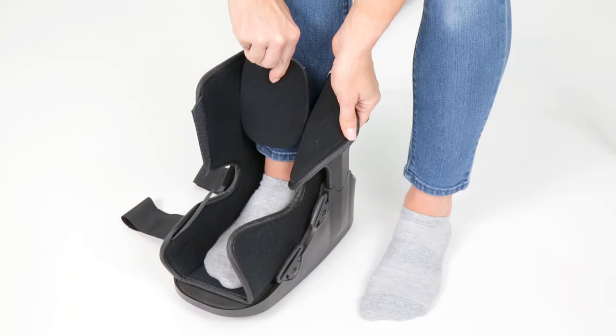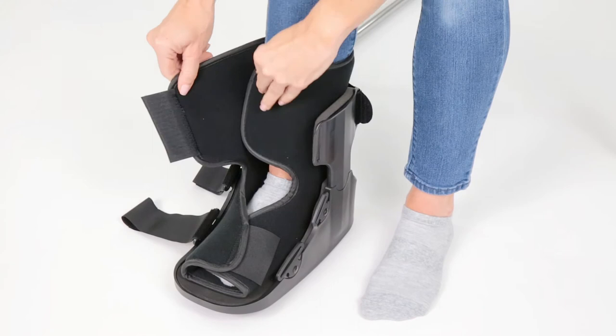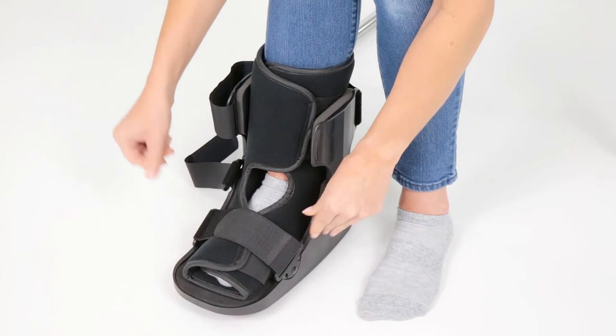Secure the bottom strap, then the top strap, for a comfortable fit. Secure the outer straps from bottom to top, and tighten to a comfortable fit. Do not over-tighten.